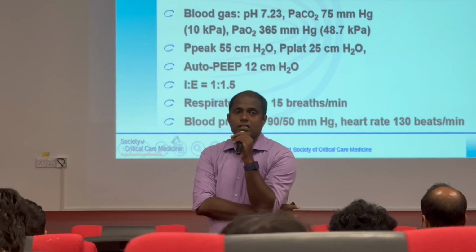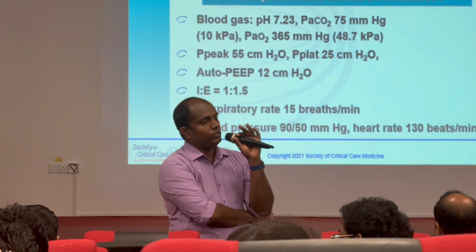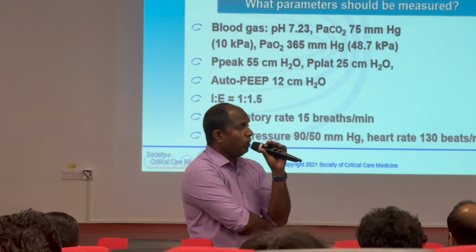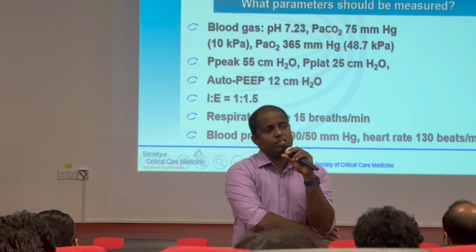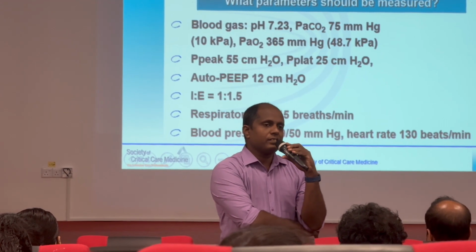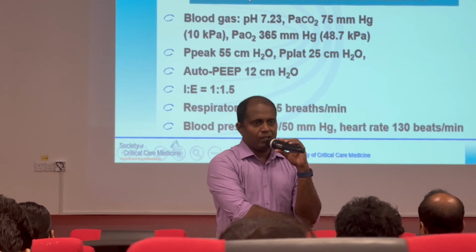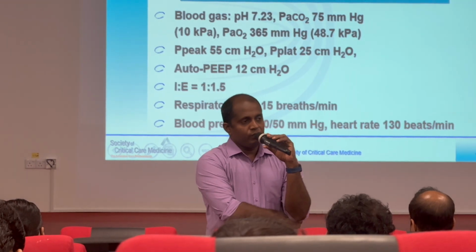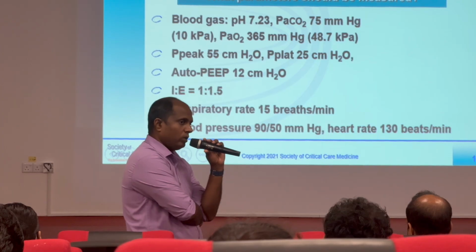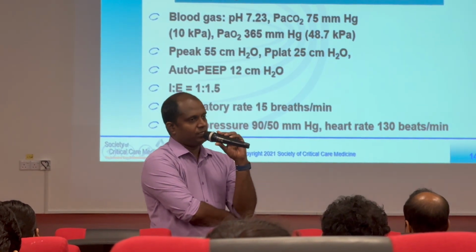The second prescription is, you can keep the FiO2 according to the oxygenation need. PEEP, always low PEEP. Sometimes we will prescribe even zero PEEP initially. So asthma prescription, always try to prescribe less than ideal PEEP. Usually we will start around 3. And if auto PEEP is detected by expiratory hold maneuver, then we will reduce the PEEP to 0 even.